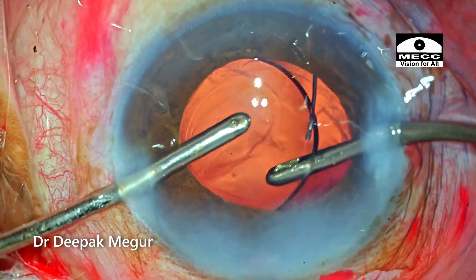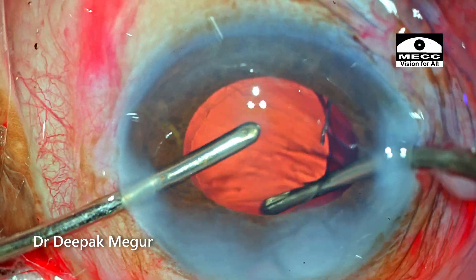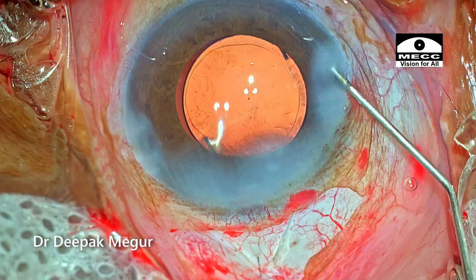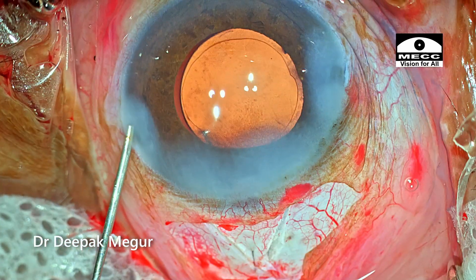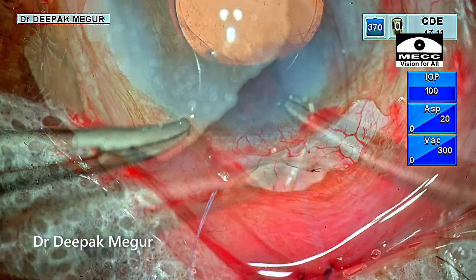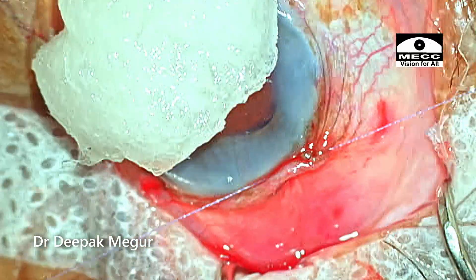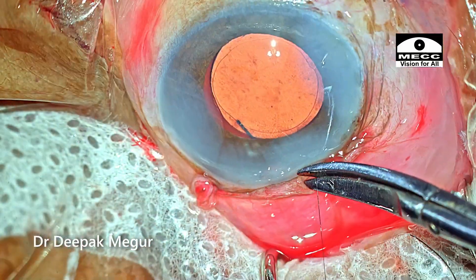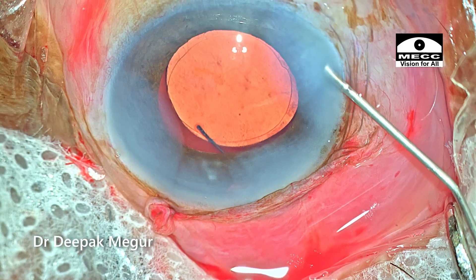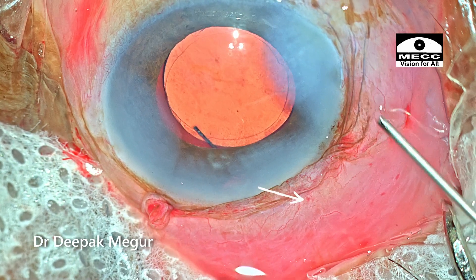In the meantime, I go ahead and remove all the OVD both in front and behind the lens. Time to close the conjunctival flap. Before finishing, I hydrate the side-port incision, and we can see that the bleb is formed.